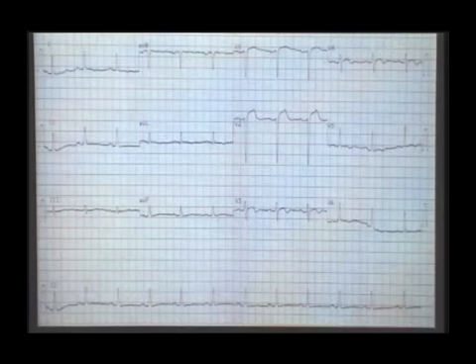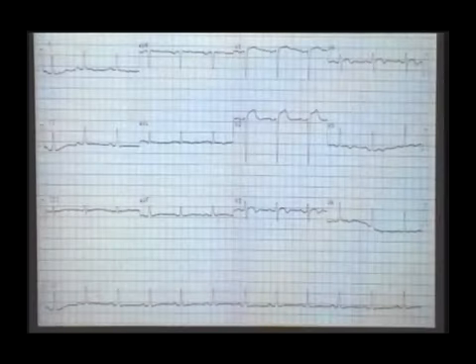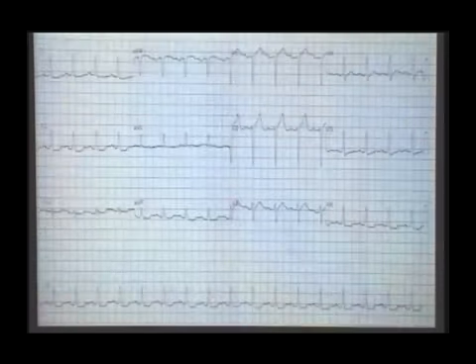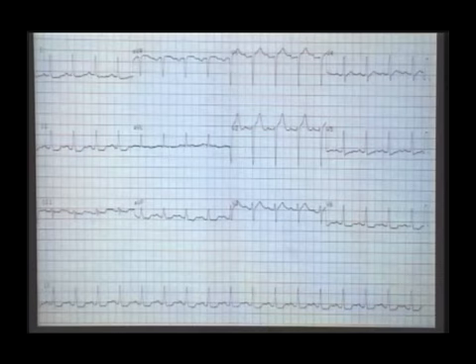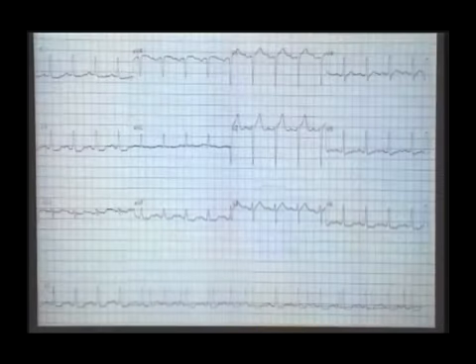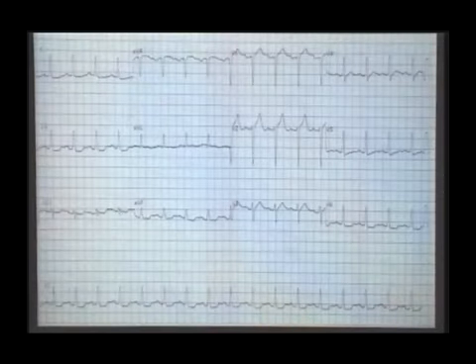You can see the next ECG of the patient after 1.5 hours. See, such a huge ST elevation has come to this type of ECG, where the R wave is continued to be preserved, V1 to V6, L1 and AVL. So everything you have saved because of the early thrombolytic therapy. So you can see at the time of discharge, the patient has got a near normal ECG. The fellow who came with this type of ECG can go with this type of ECG if you are able to intervene early.